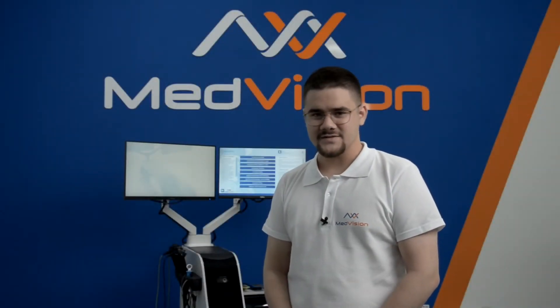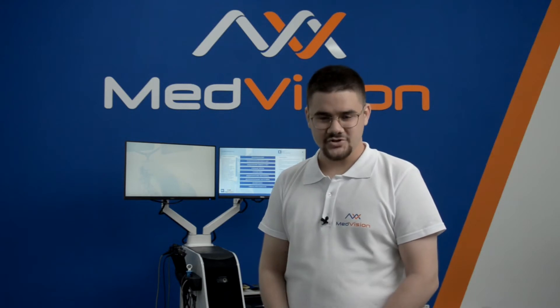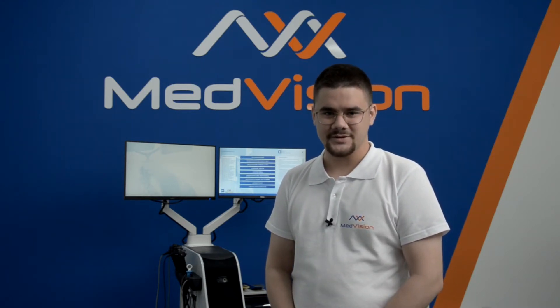Hello everyone, my name is Vsevolod Nikitin. I'm the pre-sales and after-sales director at MedVision Europe. In this video I would like to show you the endoscopy simulator EndoVision.